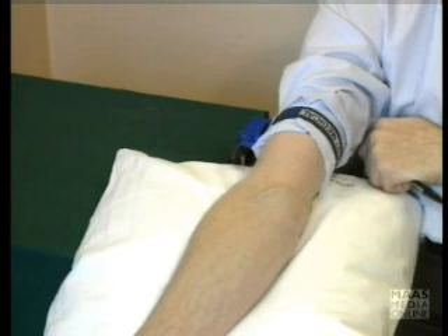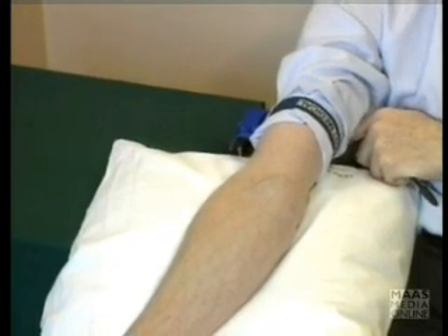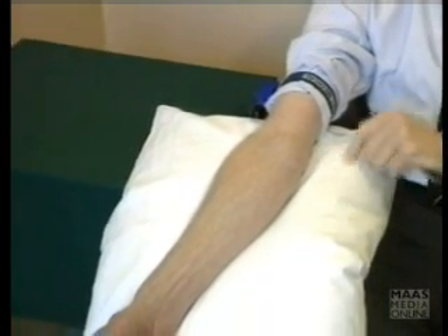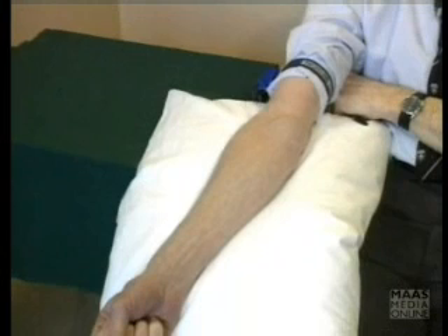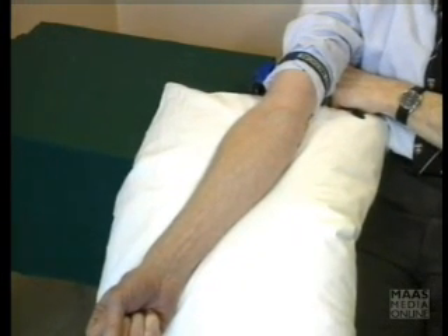When you're taking blood from a patient, which is usually going to be one of the wards, it is best to have the patient so that their arm is well supported. Whether this is in bed or on an armchair, always make sure there's something like a pillow or some other support to hold the arm steady during the actual process itself.